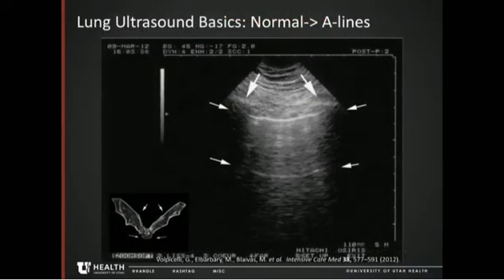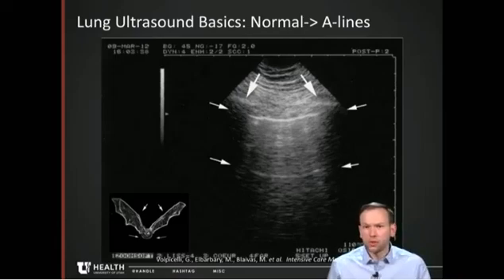So this is one of the first slides that most people see when they're learning lung ultrasound. And I will say the caveat here is that lung ultrasound is a hands-on activity. It's best learned outside of a pandemic in a group of people where unfortunately you have to get close. And so for this talk, I'm going to show you some of the basic findings, but keep in mind that you'll need some hands-on practice before you can implement these things.